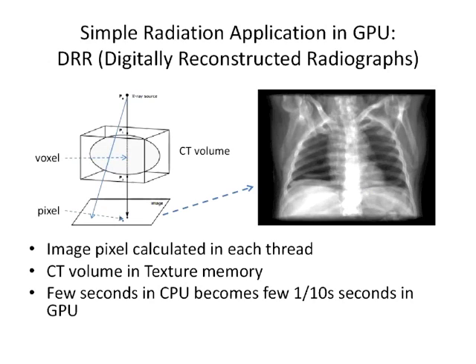A point in the volume is called a voxel, we call it, and a point in the two-dimensional image is, as you know, a pixel. So to make this two-dimensional image, you have to have many X-rays pass through the body.